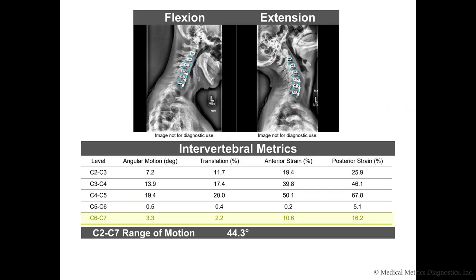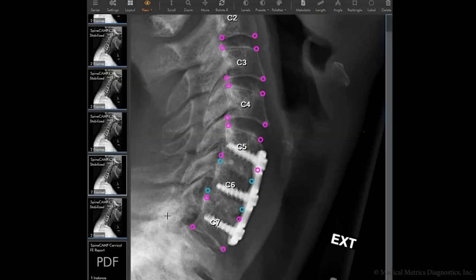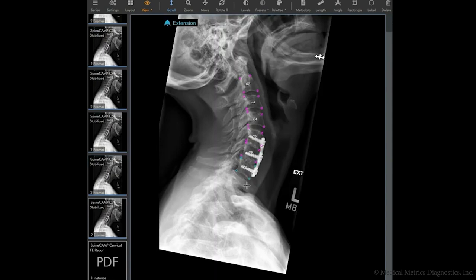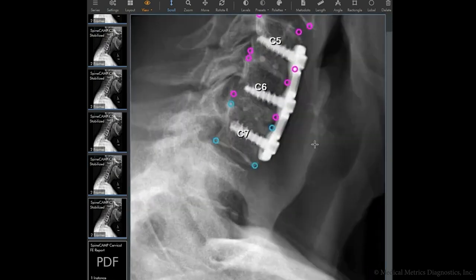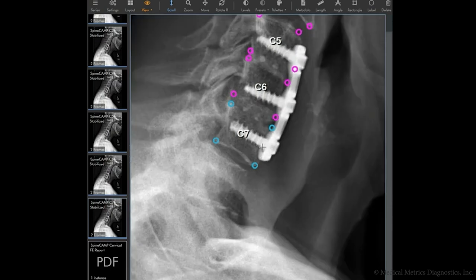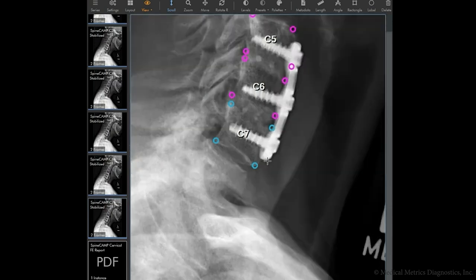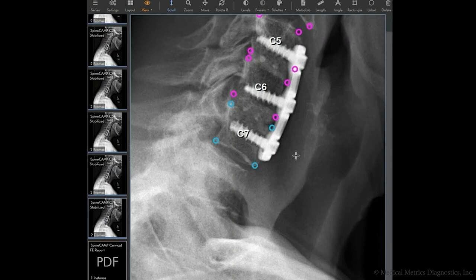Moving forward to C6-C7, looking at that row in the SpineCamp report, we can quickly see there is quite a bit of angular motion — 3.3 degrees — and the strain measured at both the anterior and posterior margins is over 10%. With that information alone, we can be confident this level has residual motion indicative of pseudoarthrosis. Pulling in the C7 stabilized imaging and zooming in, you can really see the screw toggling, lucency around the screw, the plate lifting off the vertebral body, and the rocking back and forth of C6 with respect to C7, verifying the diagnosis of pseudoarthrosis.